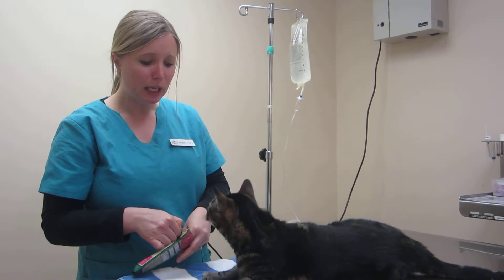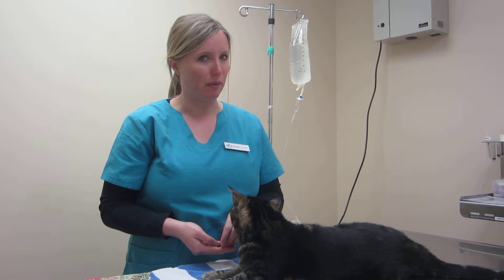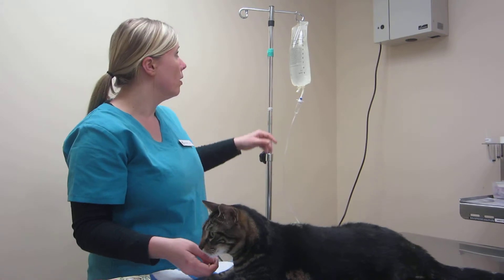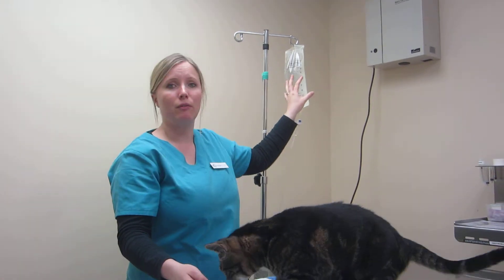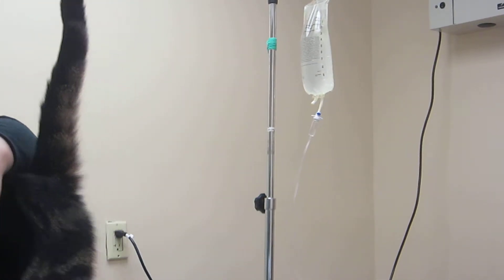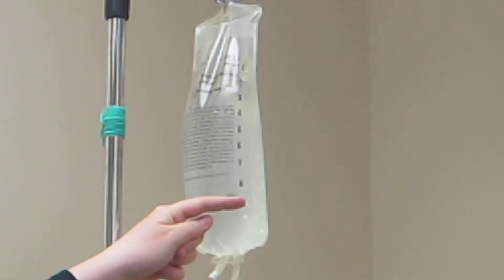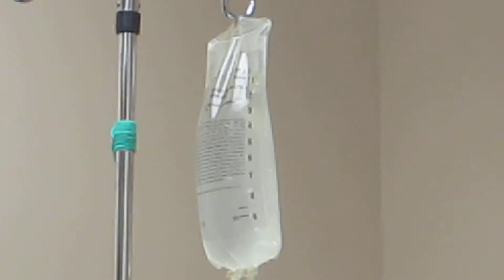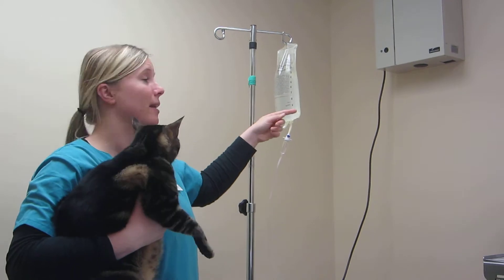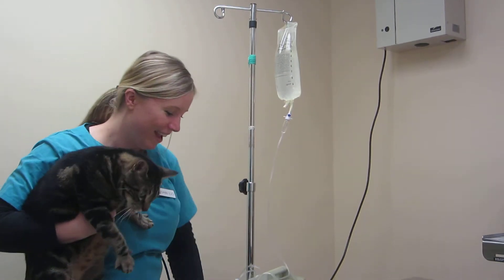We're going to go ahead and give them some fluids. If you're wondering how much you need to give, that's going to be very specific for your cat or your dog — the doctor is going to prescribe a certain amount and frequency. The most bags we're going to give you is going to be 1,000 mL — so one liter — and you'll have numbers on here. Between those lines is 100 mL. A lot of cats get 100 or 200 mL — so 150 per day or every other day — and that's what you're looking for. You're basically going to go down per line.